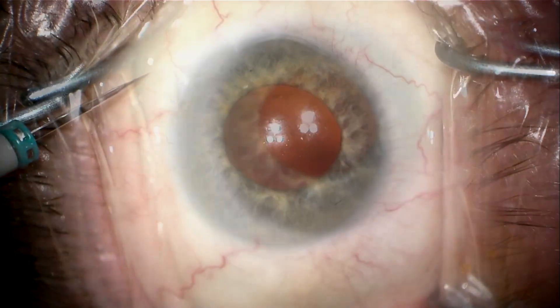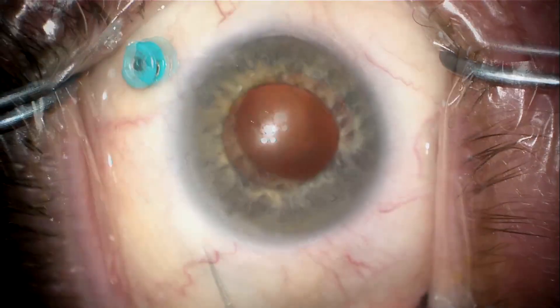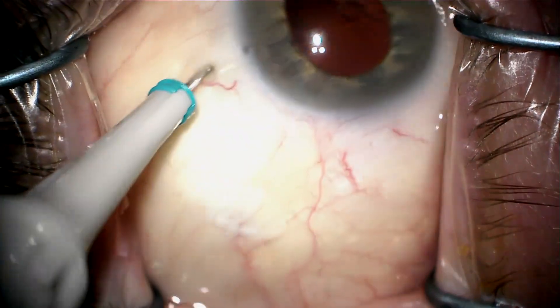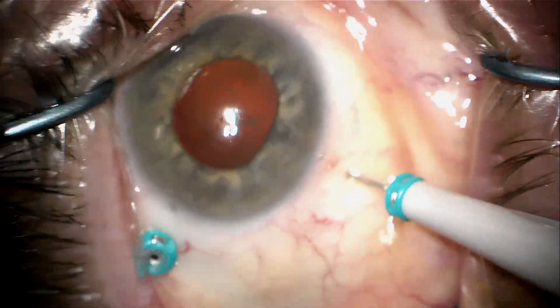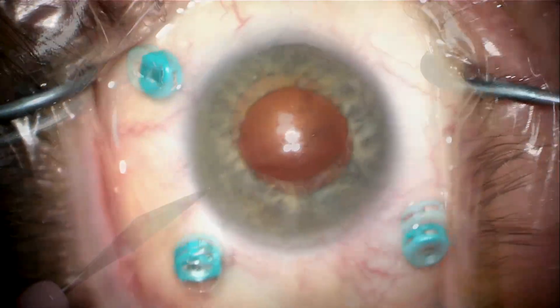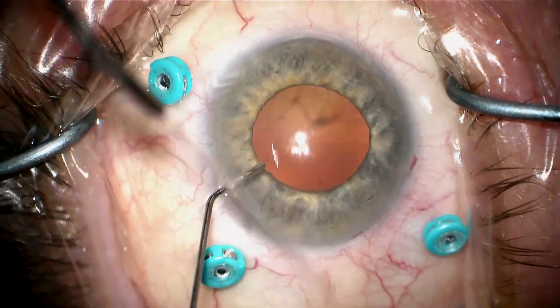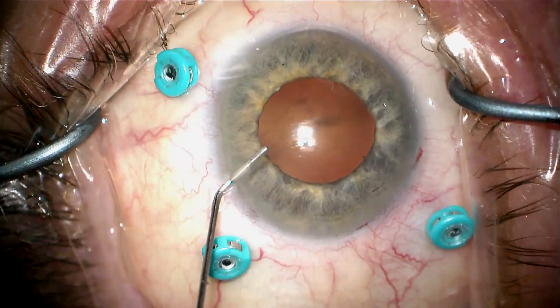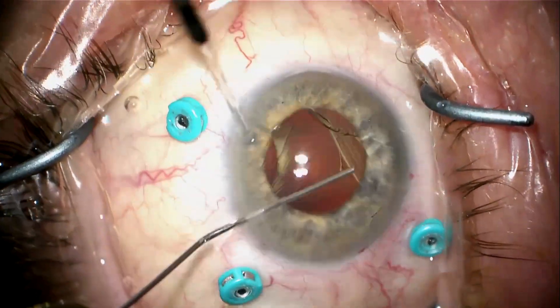This is a patient who's been referred from out of town with a 29-millimeter eye. He has not been vitrectomized and the whole lens-bag complex has dropped back onto the retina. Here we're placing 25-gauge pars plana trocars and making a paracentesis. I'm going to inject lidocaine and epinephrine into the anterior chamber to dilate his pupil a bit.